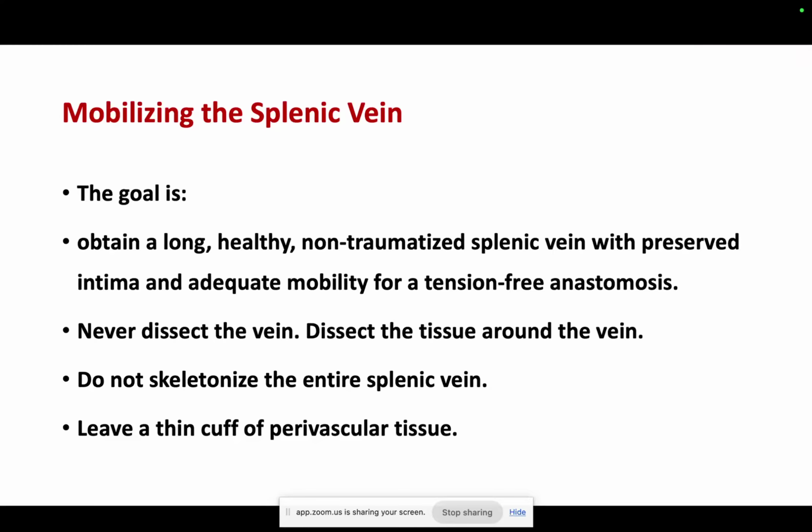One technique which has been described, and we have done also, is in those patients, especially if they have residual or big gastric varices still not fully controlled, you can actually add a fundectomy. You can just use a stapler. It helps in two ways. One, it helps to tackle the fundal varices, and it also makes that dissection technically easier. It is a described technique in those patients.